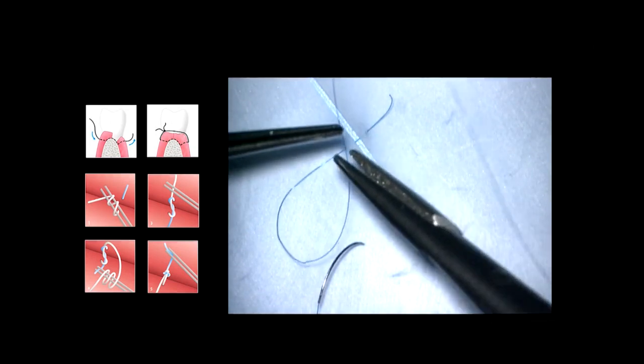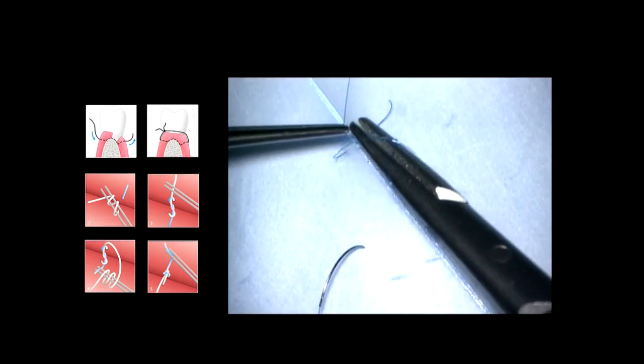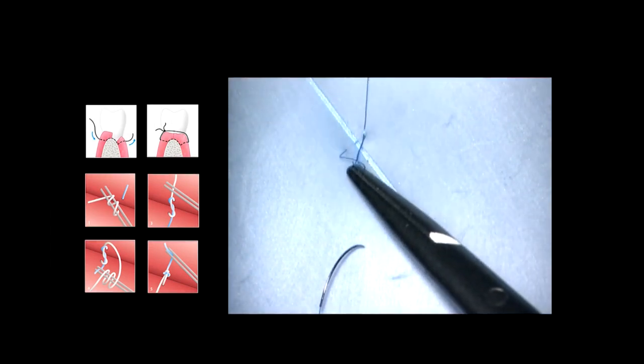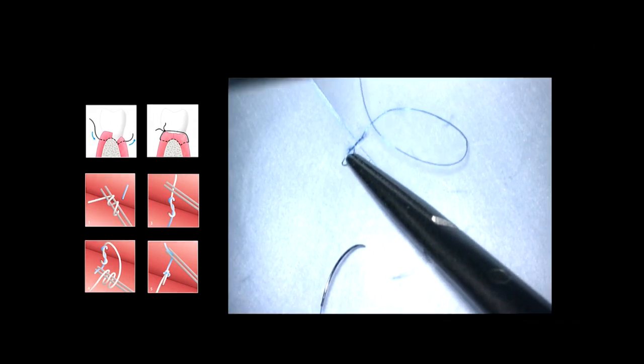When you tighten the knot, do it visually guided and not with your tactility. The reason is when you are using very thin suture diameter, you cannot have tactile feedback. That means when you pull the thread, it will break without any resistance. Something else that is important is what I already mentioned, why you choose to tighten the knots or suture with two instruments.